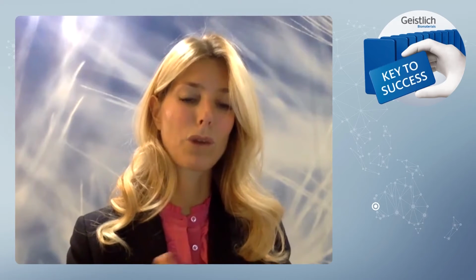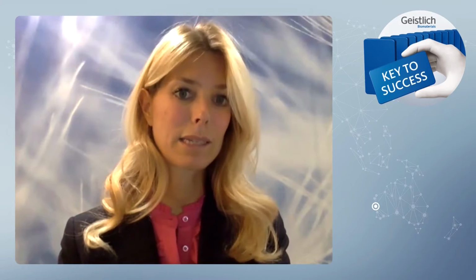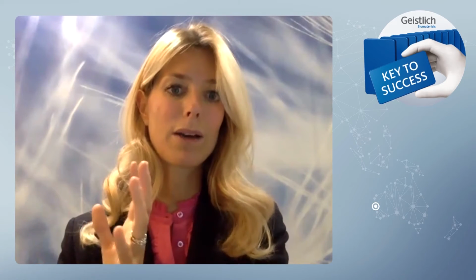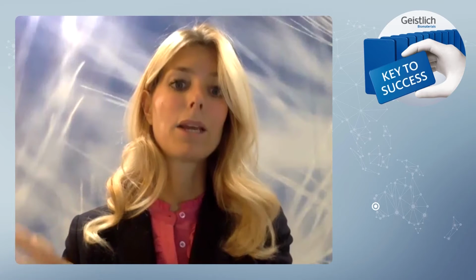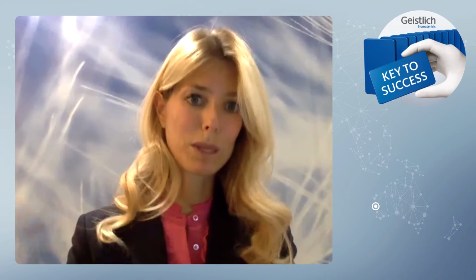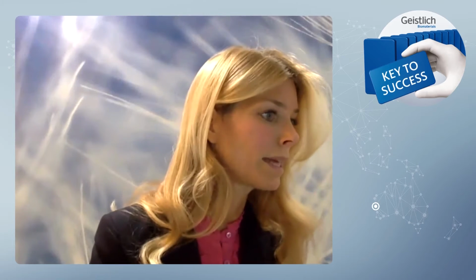So in fact, following also the Swiss experience, Ronnie Young and I have discussed this together, the protocol is to remove the tooth, do absolutely nothing, to be able to intervene very rapidly. 6 weeks later, you're only waiting for the soft tissue closure, and at that point, with your CBCT scan, you have the bone, which is a virgin bone, and you can then plan your implant in the right position if you have enough for primary stability, with or without GBR, or GBR alone, and then the implant. Obviously this question requires probably a full lecture with diagrams, but I hope I've replied.